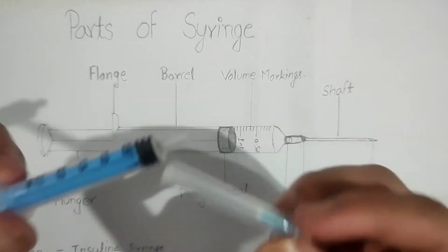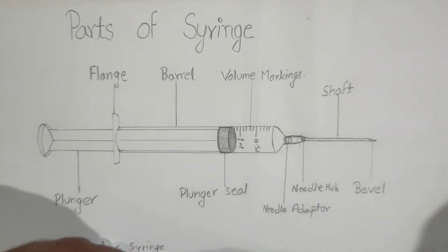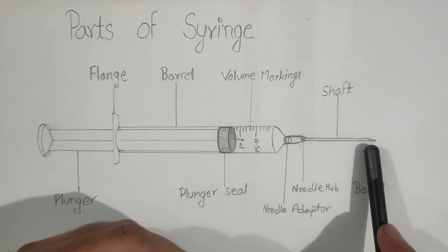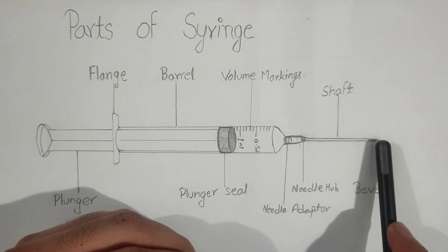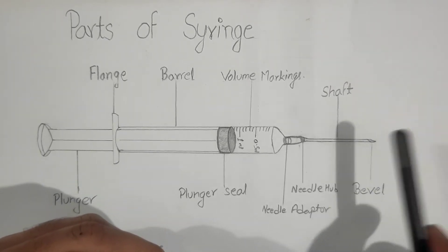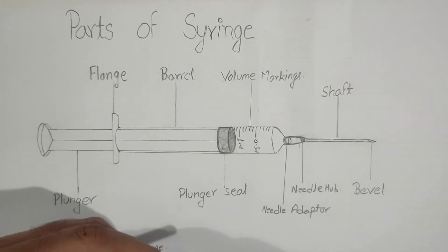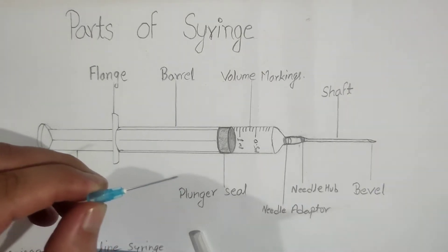Starting from the top, you can see this needle part which is sharp and pointed with a slantly cut hole, which is known as the bevel, and sometimes it is also known as the bevel angle.